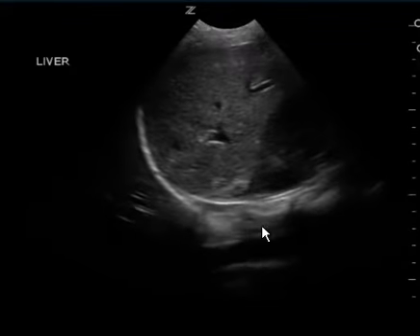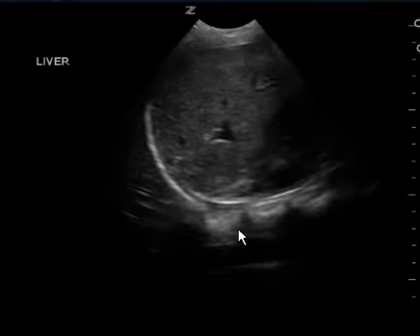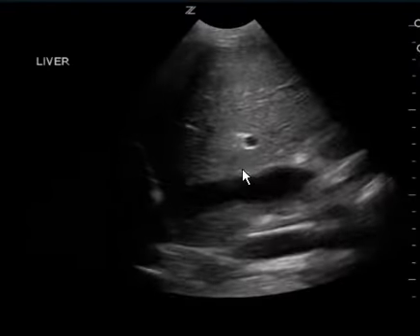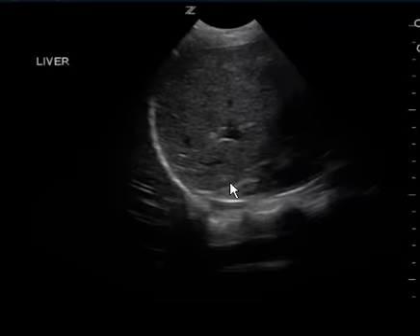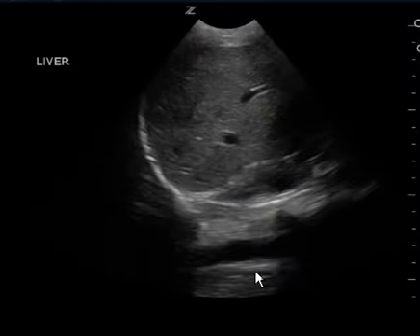Same thing here with your right upper quadrant. I can see here a very good image of the diaphragm and you have the spine here. I get a little bit of the IVC that comes into view, which is good. But I don't see much of Morrison's pouch. I don't see a good view of the kidney in relation to the liver, and I don't see the inferior pole of the kidney as well.